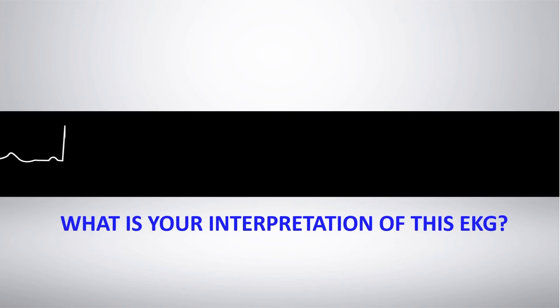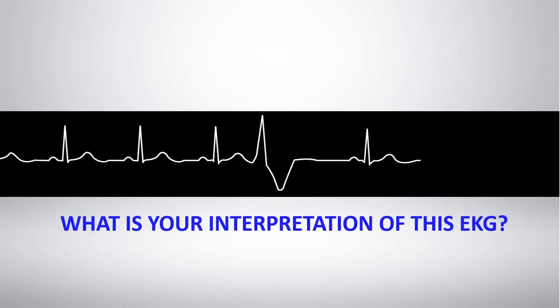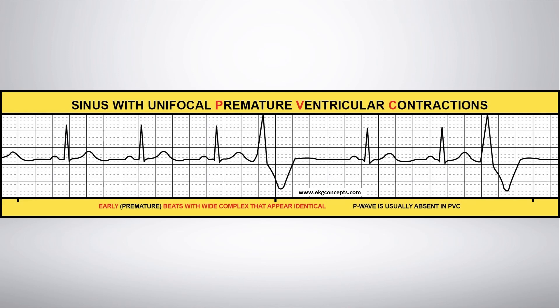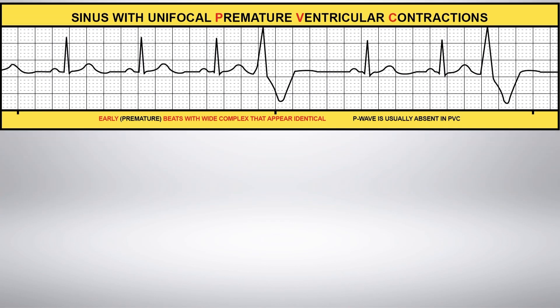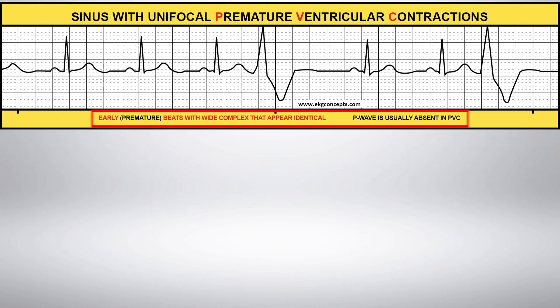What is your interpretation of this EKG rhythm strip? Sinus with unifocal premature ventricular contractions.